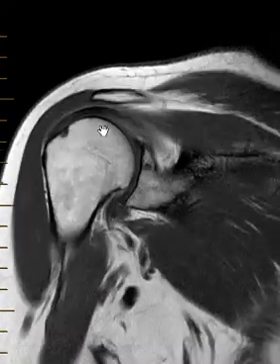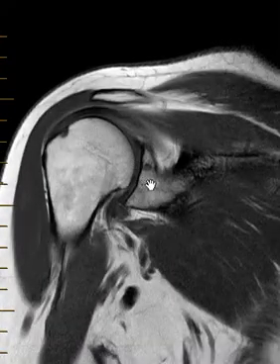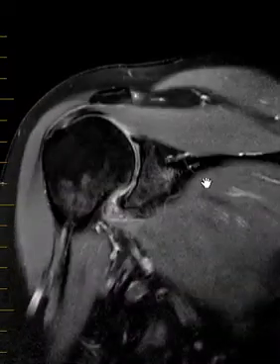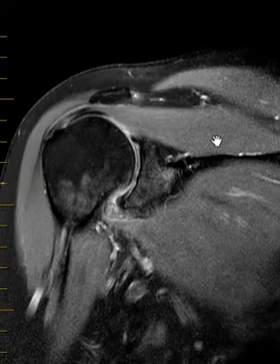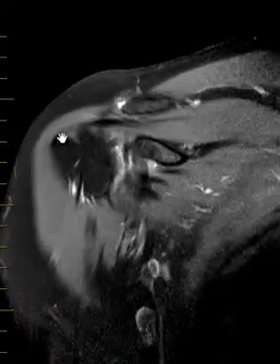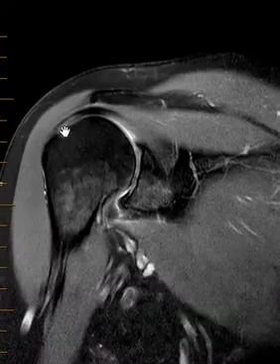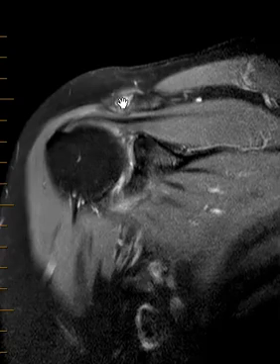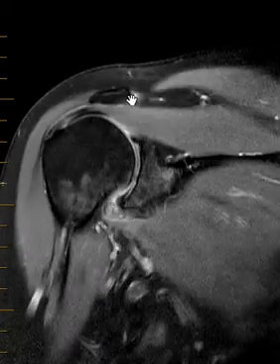Her AC joint looks good. Her glenohumeral joint looks very good. She has no rotator cuff tear. We can see this coronal PD fat sat view — you can see the supraspinatus coming across, coming down here. You could argue there may be a little bit of tendinosis, but really the rotator cuff looks good with no full thickness tear. Tiny amount of fluid in the AC joint, so overall things are very very good.